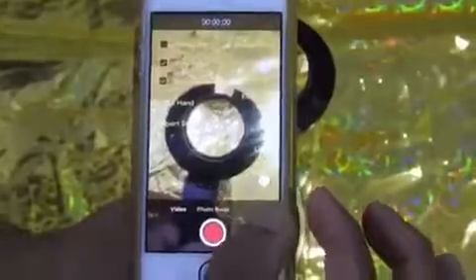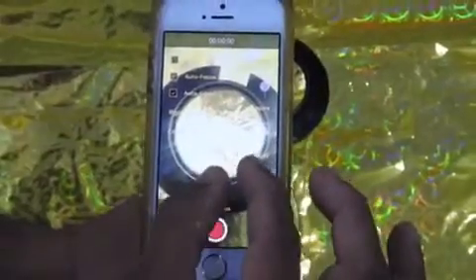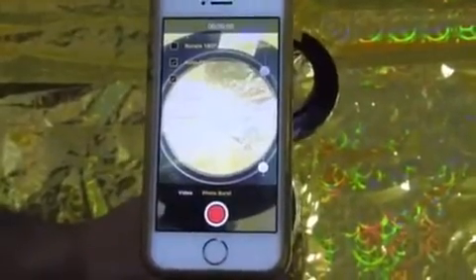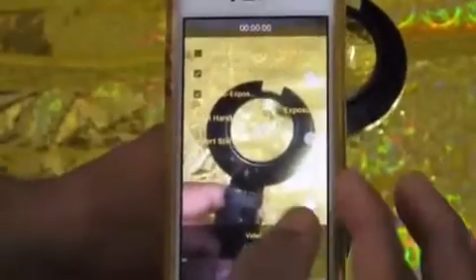Fill the full screen of the mobile with the lens by zooming the image. This Ulman app is available for free download on your app stores.